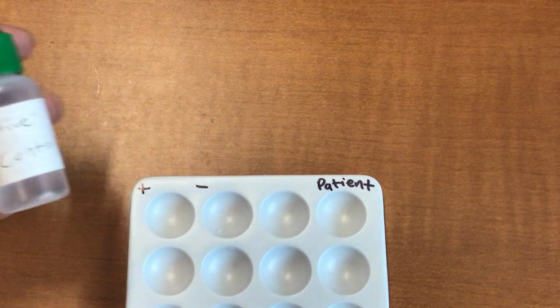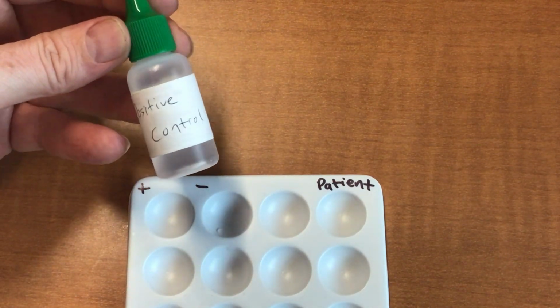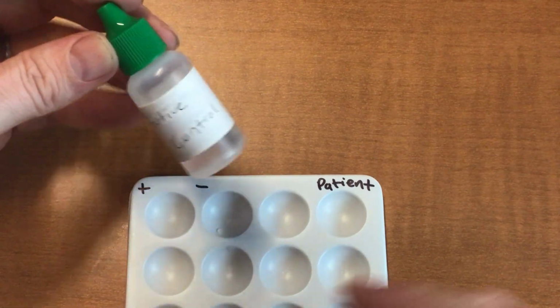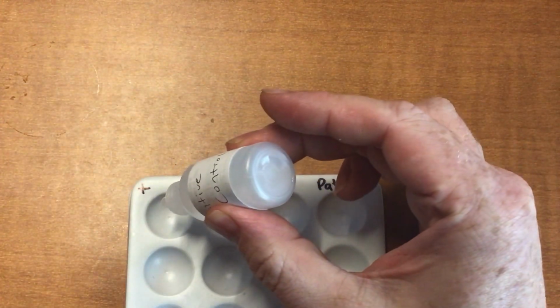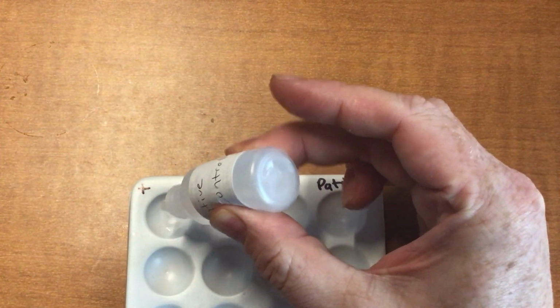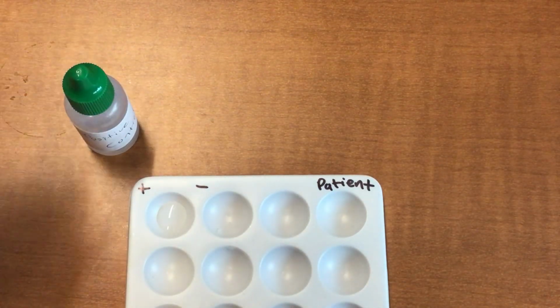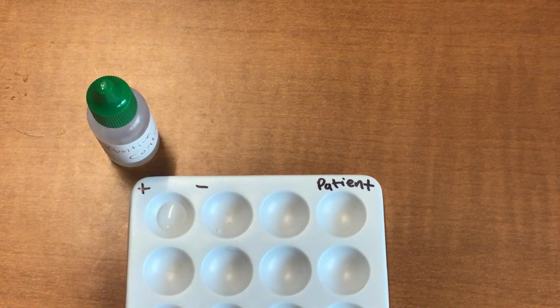All right, so let's say you're testing for salmonella. The laboratory will actually get a sample of salmonella, and they're going to compare it to it. So it'll be a control. So this is your positive control. This is going to symbolize an actual sample of salmonella. And we're going to pour that sample, 3 or 4 drops, into the positive cup. So 4 drops there. All right. So that is a sample of someone who is positive for salmonella.